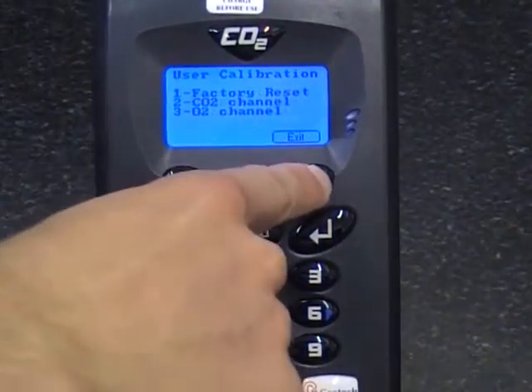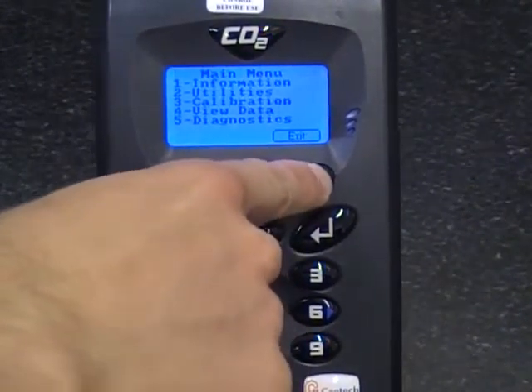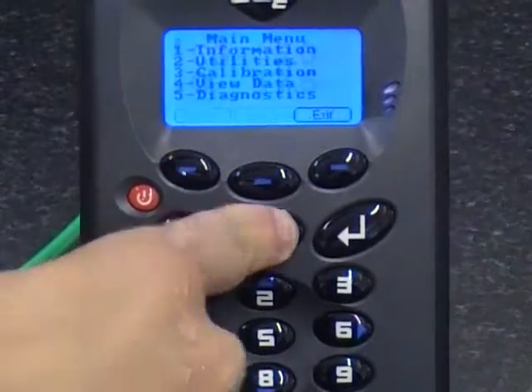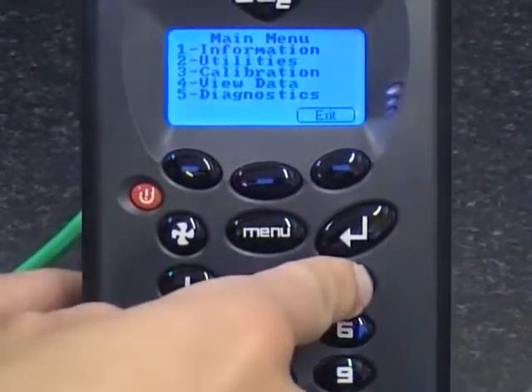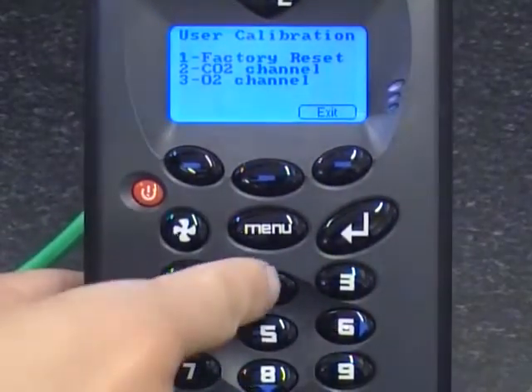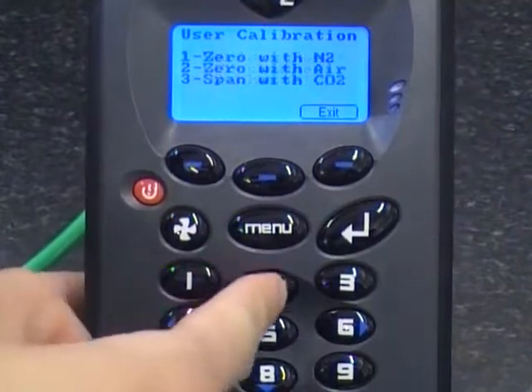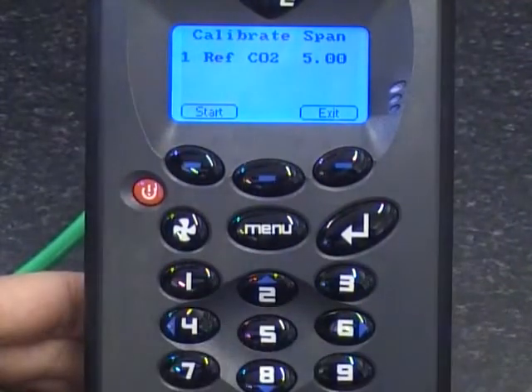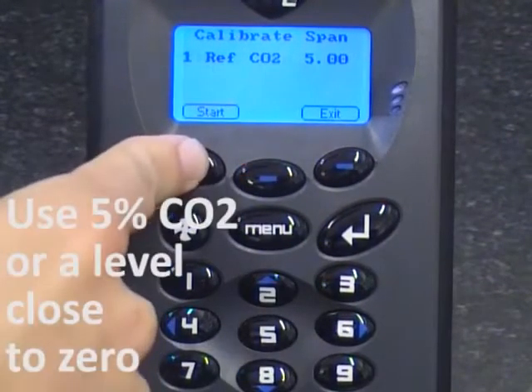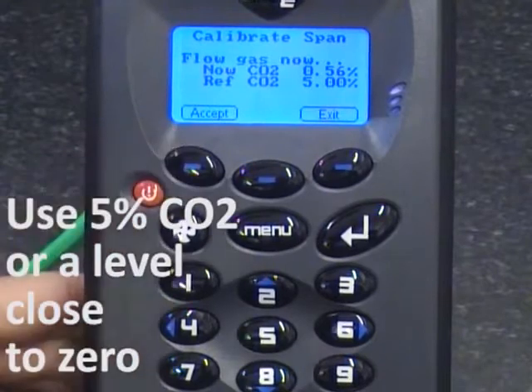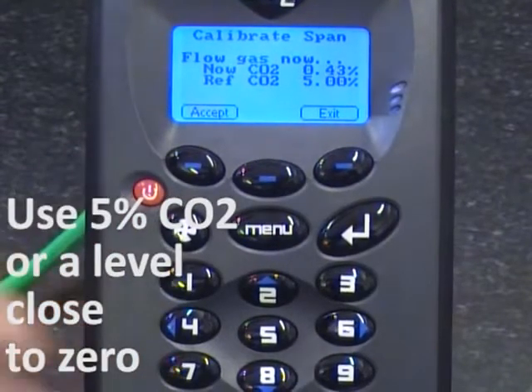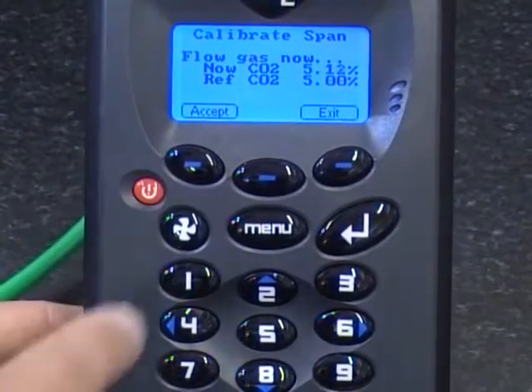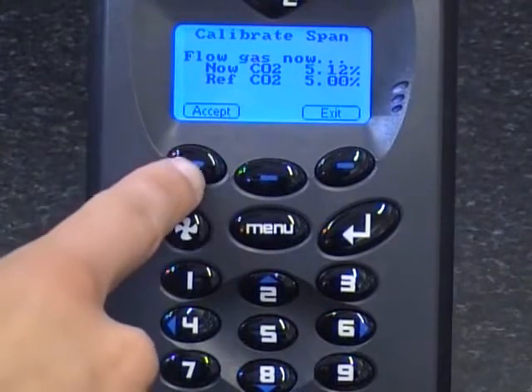Next, we will span the CO2 channel. Press the menu key. Press 3 for calibration and then press 2 for the CO2 channel. Select key 3, span with CO2. Press the start button and let the reading stabilise. Once it has stabilised, press accept.